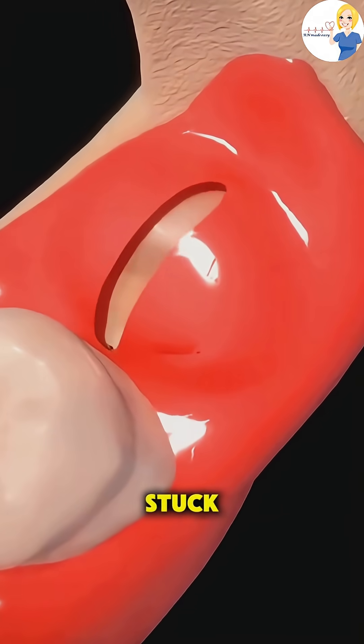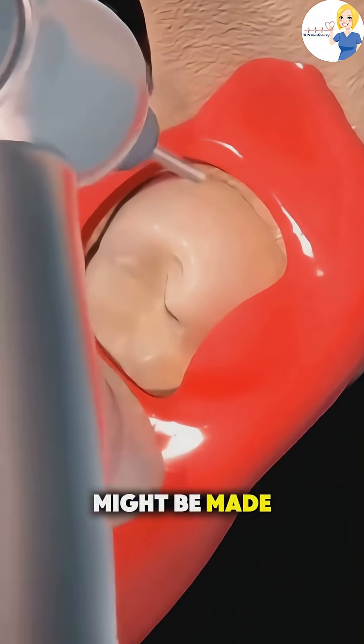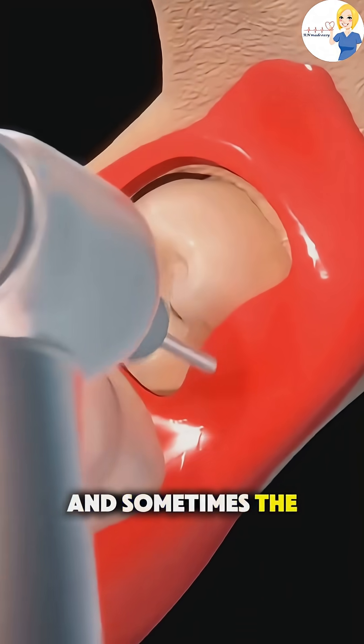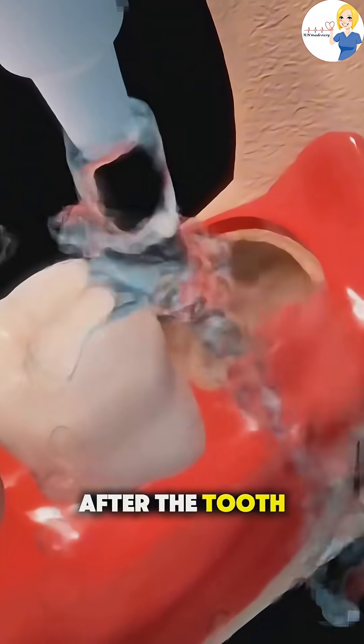If the tooth is broken or stuck, like with wisdom teeth, a small incision might be made in the gum, and sometimes the tooth is divided into smaller pieces for easier removal.